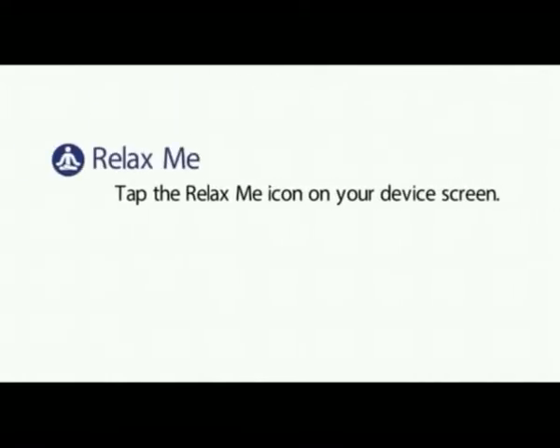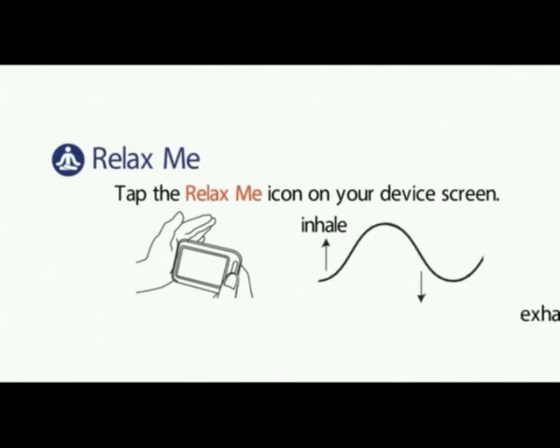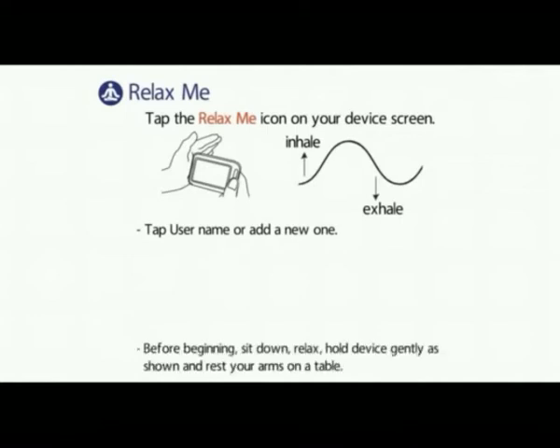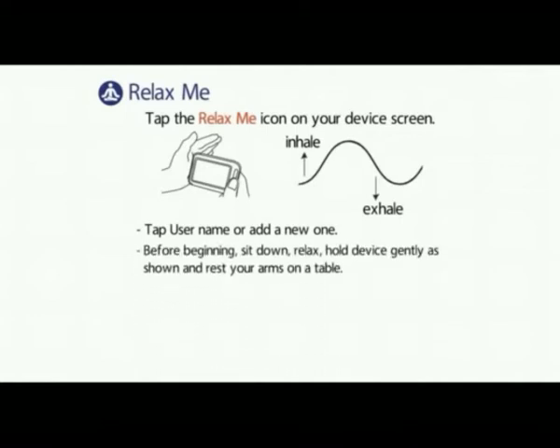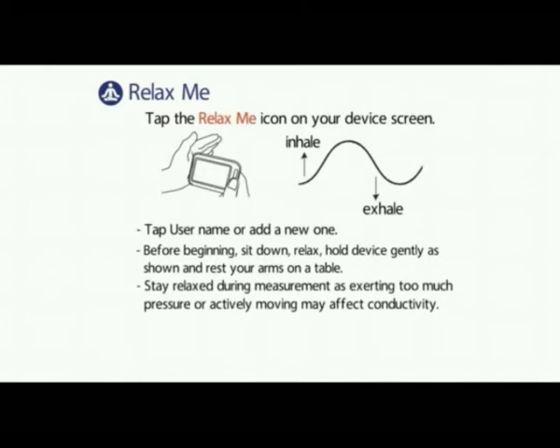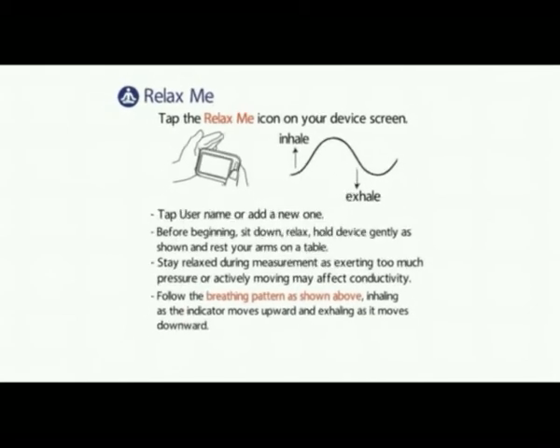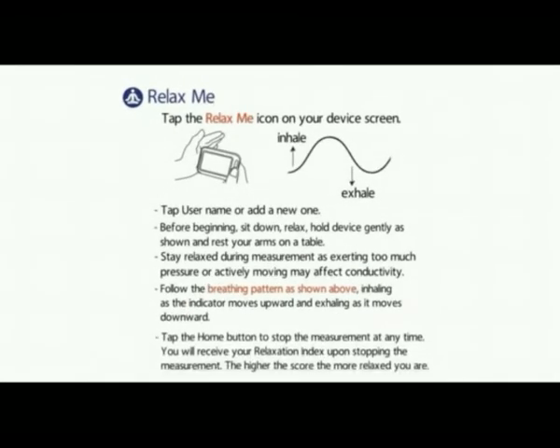Relax me. Tap the relax me icon on your device screen. You will be inhaling and exhaling during the process. Tap username or add a new one. Before beginning, sit down, relax, hold the device gently as shown, and rest your arms on a table. Stay relaxed during the measurement as exerting too much pressure or actively moving may affect conductivity. Follow the breathing pattern as shown, inhaling as the indicator moves upward and exhaling as it moves downward. Tap the home button to stop the measurement at any time. You will receive your relaxation index upon stopping the measurement. The higher the score, the more relaxed you are.